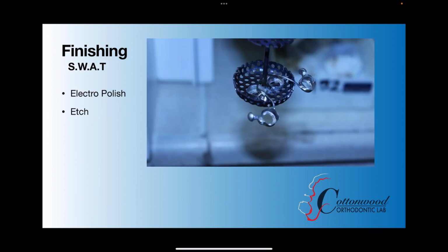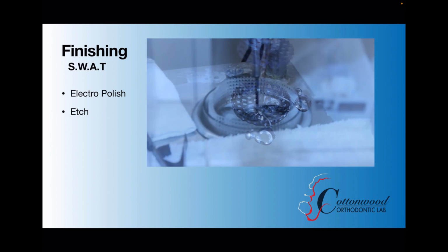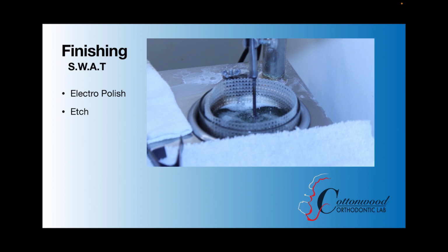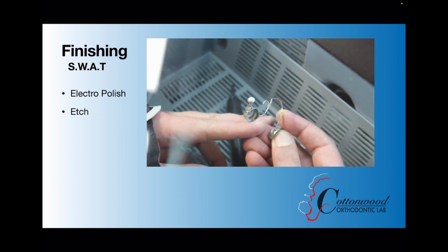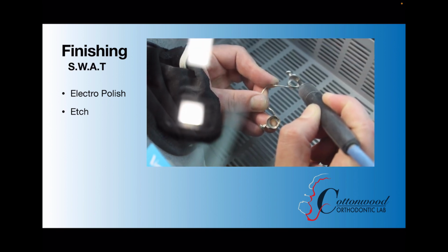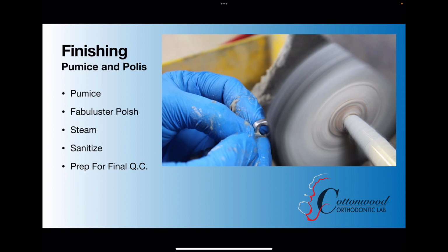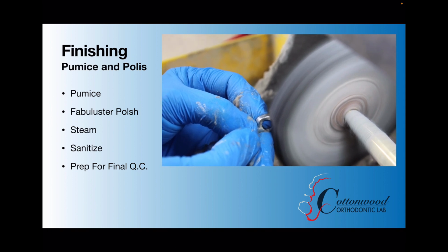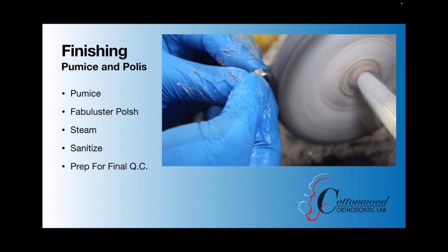So after that, we send it to the ESMA. We do about 30 seconds of electro polishing on the upper and the lower. Really just helps clean the appliance up. And then after that, we take it to the micro etcher, and we always etch out our crowns or bands. So for the final cut, pumice and polish. Once again, pretty straightforward. We don't do anything too fancy here. Just regular pumice and polish. We like to just use Fabuluster, and then we're going to steam this off and sanitize it.